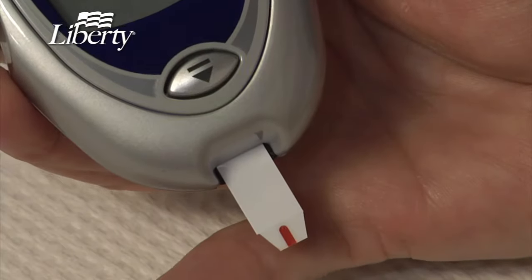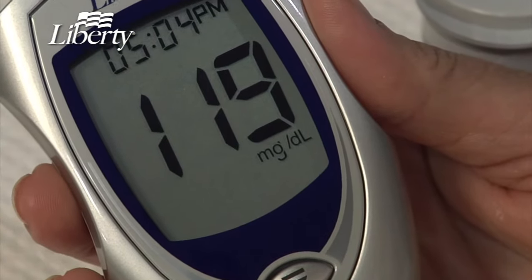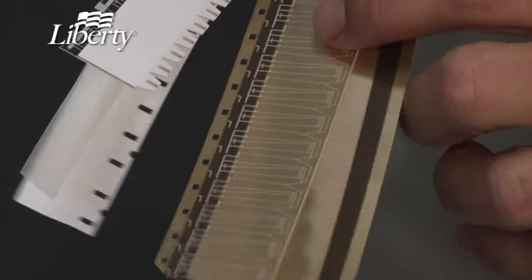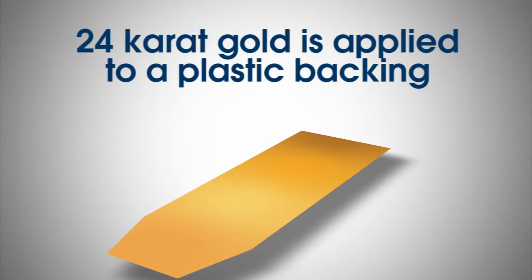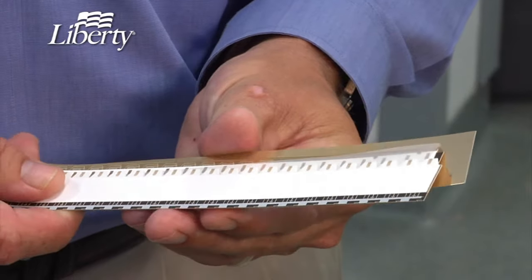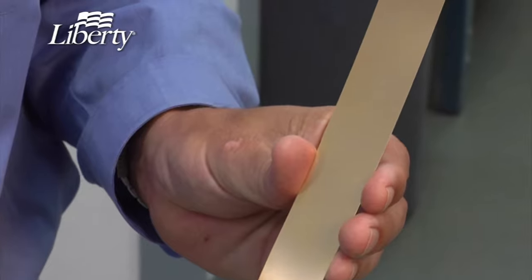The strip and meter technology working together produces blood glucose readings in as fast as four seconds. The strip manufacturing process uses multiple layers of materials. Our base material is constructed using 24-karat gold that has been applied to a rigid plastic backing. Gold is an extremely efficient conductor of electricity that improves the accuracy of the results.